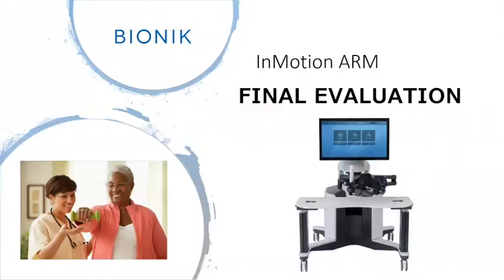After 6 sessions of treatment for this patient, using both robotics and traditional techniques over a period of 13 days, the team was able to determine that the patient was ready for discharge to either home or another level of care. So we want to make sure that we get a recording of the patient's final evaluation status so that we can compare how much progress this patient made during their stay.